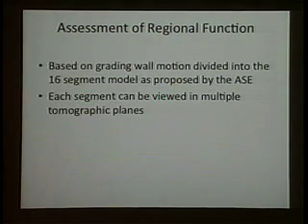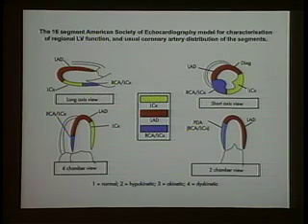So again, because we're looking at different walls in the heart, you can then have an idea of which coronary can be affecting the perfusion of the heart, and you can make a diagnosis of a problem. And again, different areas of the heart are basically irrigated by different coronaries, and then you can establish, depending on the view, which coronary can be affected. And if you look at your short axis parasternal view, this is your circumflex, this is your right coronary, and this is your LAD that is including the septal wall, the anterior wall.